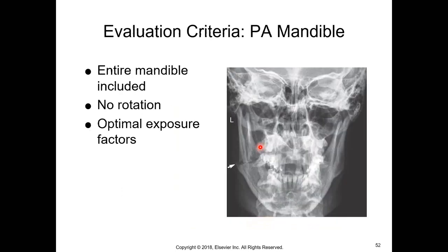So here is a regular PA. You can see the jaw, that's ouch. That hurts right there. There's a fracture there. But a regular PA looks like this. I don't have another image with the angle on it, but with an angle, let me try and draw it with my lovely drawing skills.